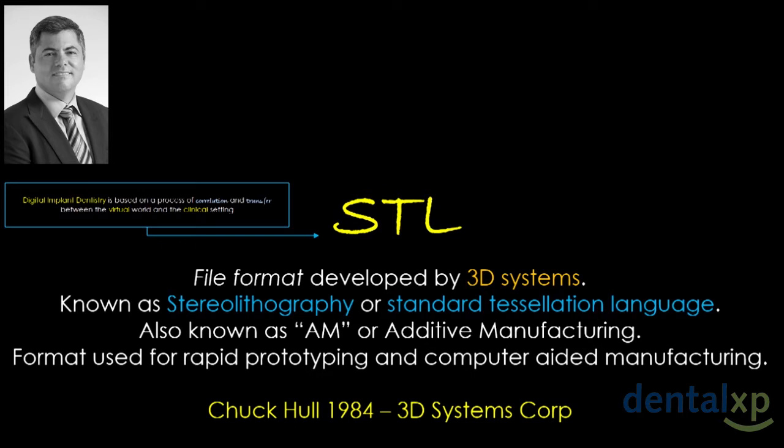So STL did the same. You got a machine that was made by one company, now communicating with a machine that is made by a different company. And utilizing these 3D formats, the different machines can now accept files, share files, export files, and be able to utilize information from different aspects. And this was something that happened within the last 10 years. And we call that open architecture. The open architecture basically gives you the opportunity to communicate different machines. There are other machines that have closed architecture, which basically means they only speak one language.